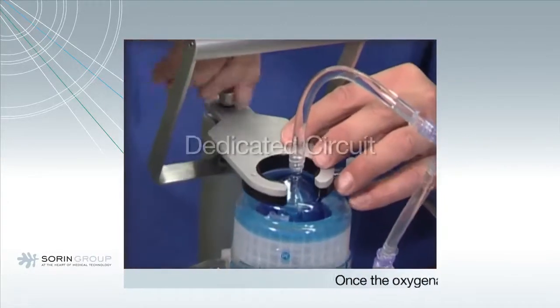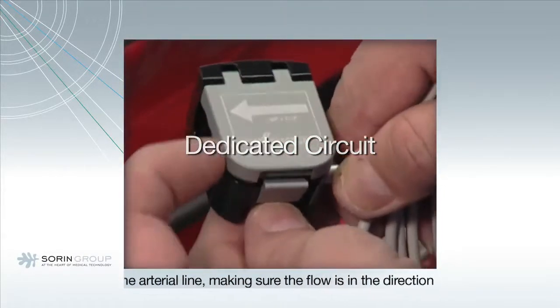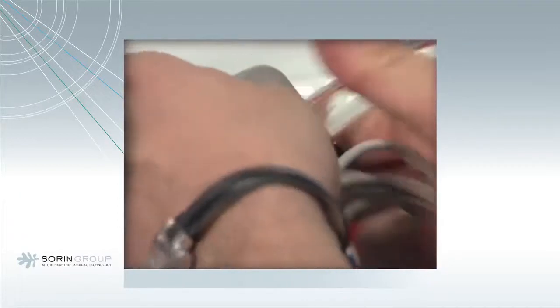Use the upper plate to secure the oxygenator. Place the flow sensor on the arterial line. Make sure that the direction of flow is in the direction of the arrow indicated on the flow sensor.